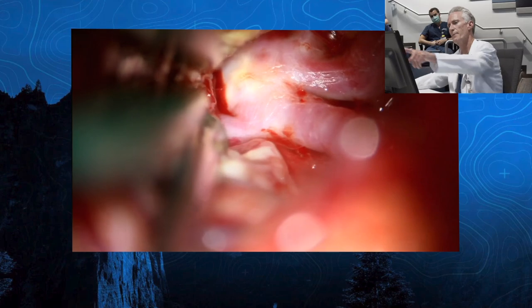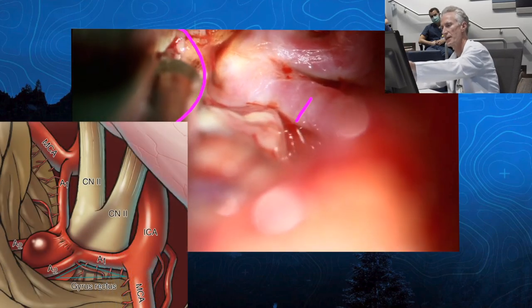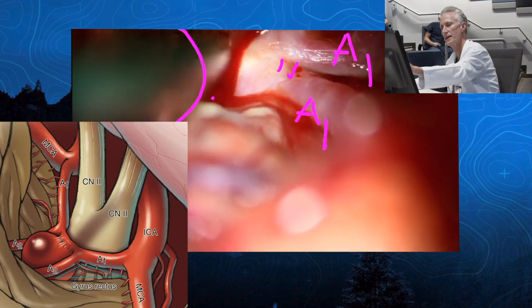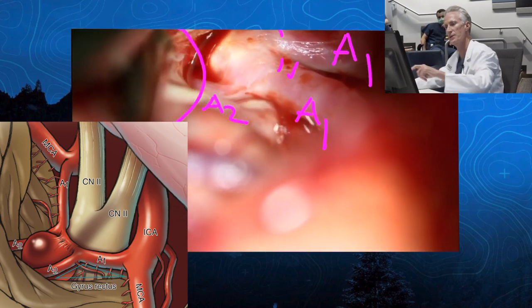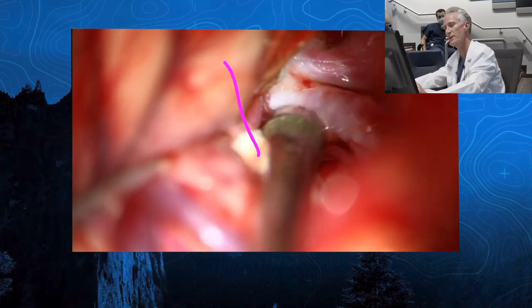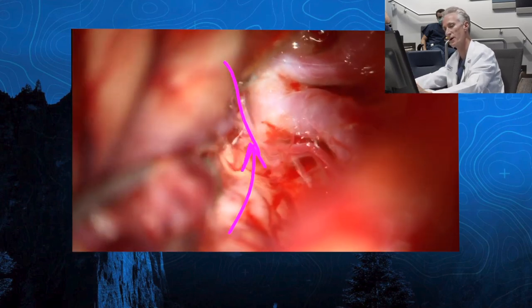You can see how I've taken a little bit more gyrus rectus here, and now this is the A1 ipsilateral. Here's the A1 contralateral. Here's the ACOM. We've got the A2 up here, and off the screen is the A2 on the other side. There's another example of an orbitofrontal that comes off really early, and that was locking in the gyrus rectus, making it hard to get into that junctional triangle.